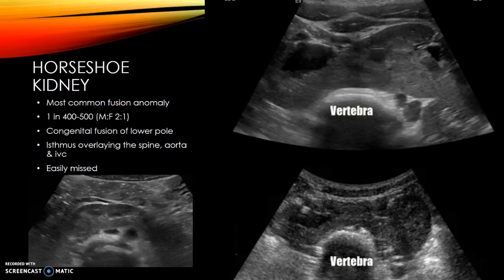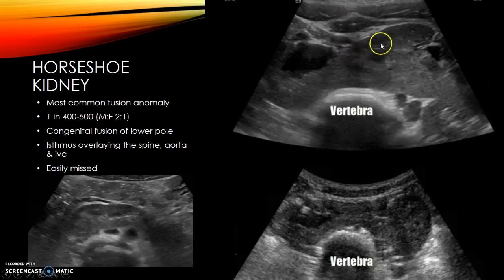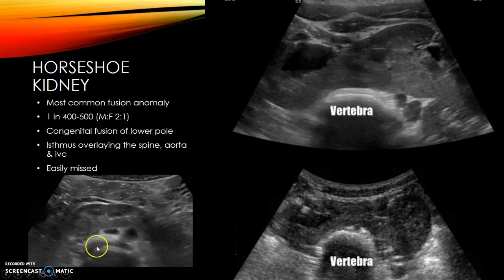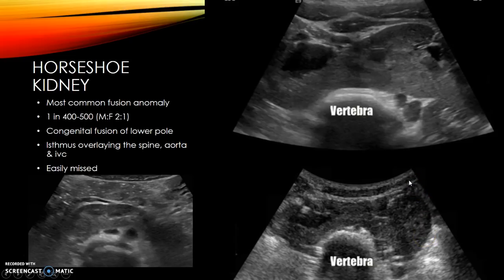Horseshoe kidney is one of the most common fusion anomalies, seen in 1 in 400 to 500 births and more common in males. It's a congenital fusion of the lower poles, usually with an isthmus overlying the spine, aorta, and IVC. On imaging you can see the isthmus with the left and right kidneys on either side and their respective renal pelvises. These are easily missed — if you're having trouble getting a nice rounded lower pole view, angle inferiorly to see if the kidney crosses over and fuses with the other.